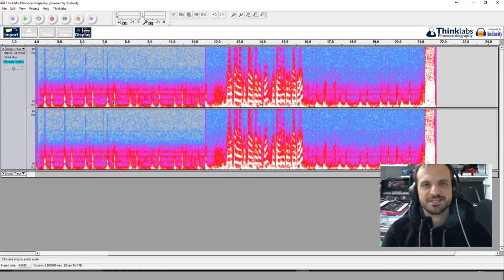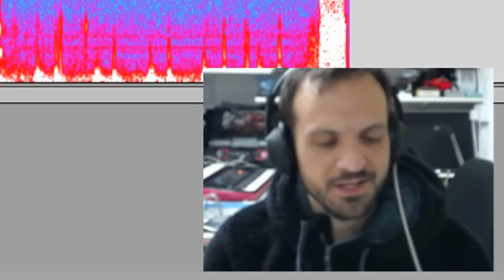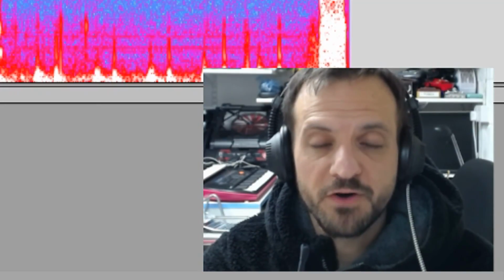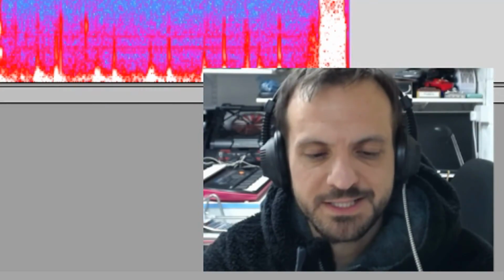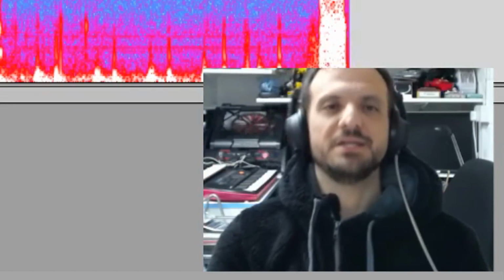So it's very easy to hit distortion on this because you're running the microphones on maximum gain. But, you know, it's a lot of fun, really. And I think if you've got one of these, and you can buy these cheaply, you can have a listen. Now, I wouldn't advise you do this for any sort of medical reason, to be honest, because the quality's going to be really terrible. It's nowhere near as good as using your ears. Your ears are obviously the right sensitivity, and this has been adjusted for human ears rather than digital ones.